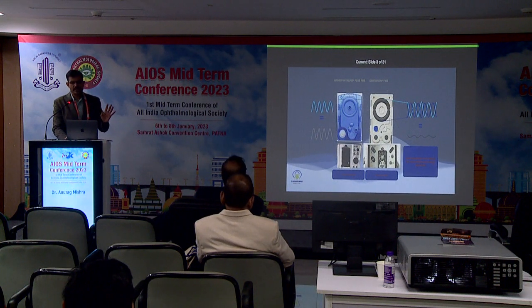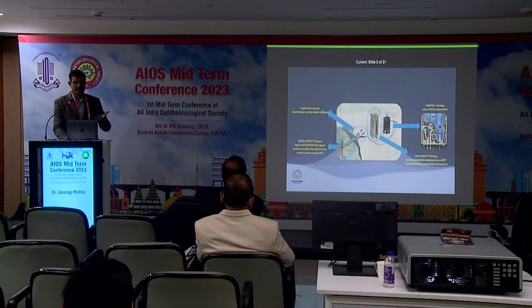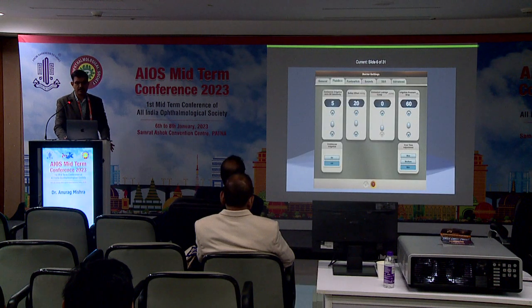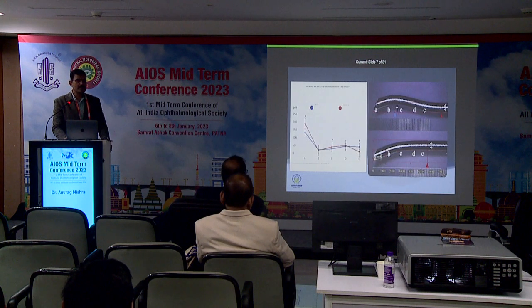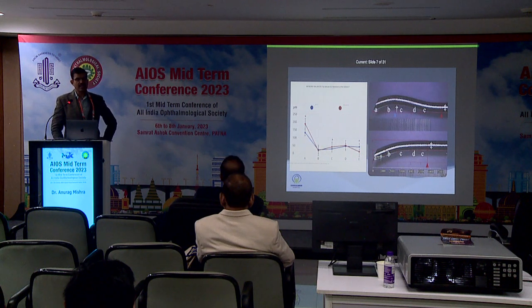I'm not going into the details of this because we don't have an audience before whom we should be speaking about it; we all have dissected the inside of the machine. We know how things work there. The only thing that Active Sentry has added is the additional irrigation sensor in the handpiece, and I think more important was the invention of the balance tip, even more than Centurion itself.